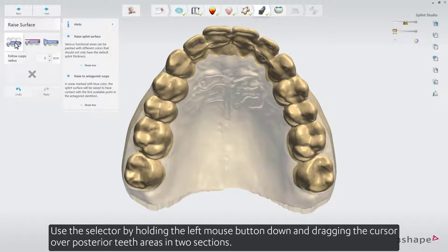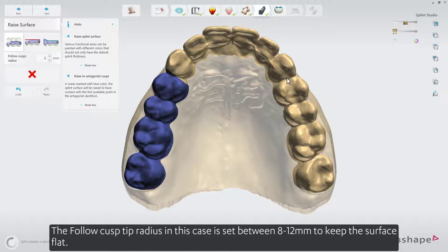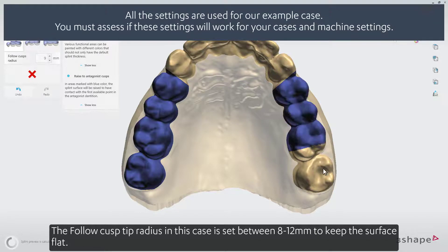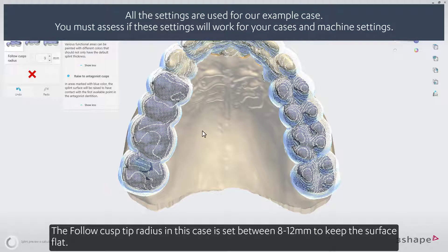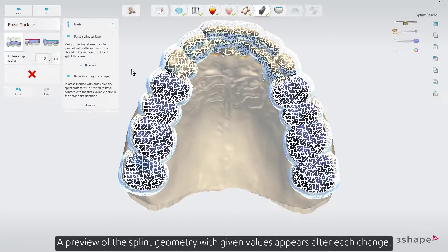Use the selector by holding the left mouse button down and dragging the cursor over posterior teeth areas in two sections. The follow cusp tip radius in this case is set between 8 to 12 mm to keep the surface flat. A preview of the splint geometry with given values appears after each change.